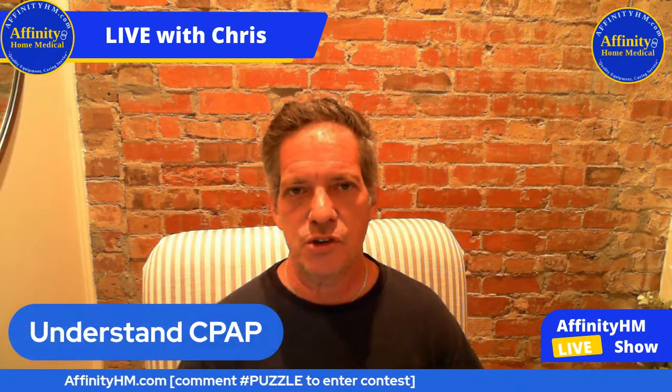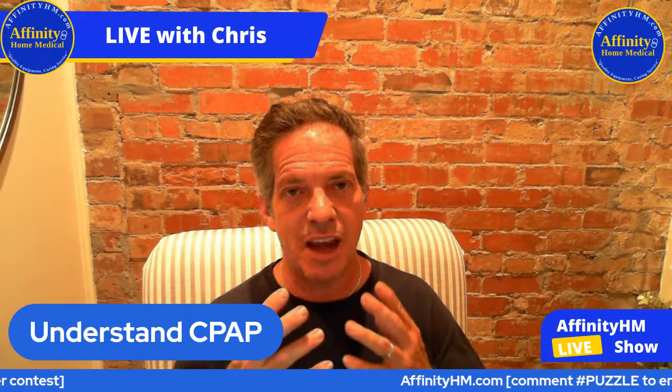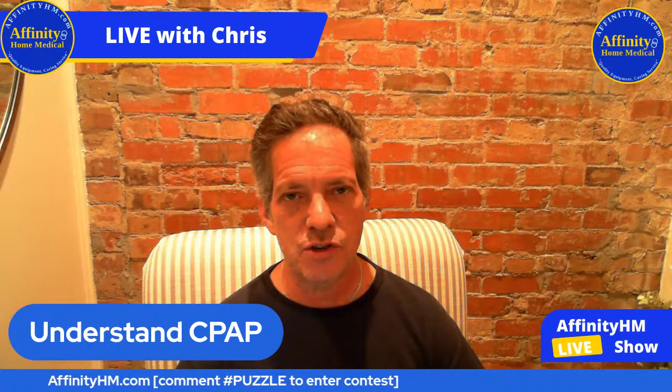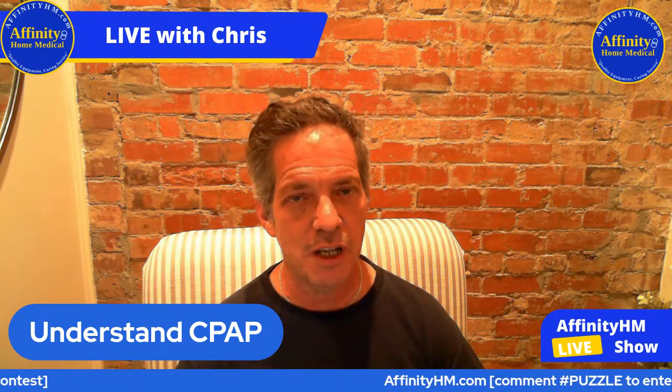So continuing with the puzzle, to build your understanding, understand CPAP is just a direct solution for what's happening with this airway closing off. CPAP stands for continuous positive airway pressure. And this pressure is coming in via machine is driving the pressure. You've got it coming in via a mask or a nasal pillow.